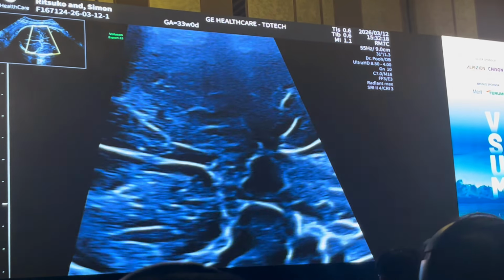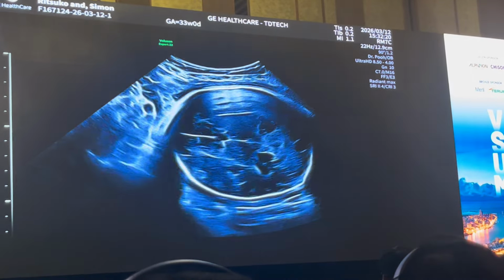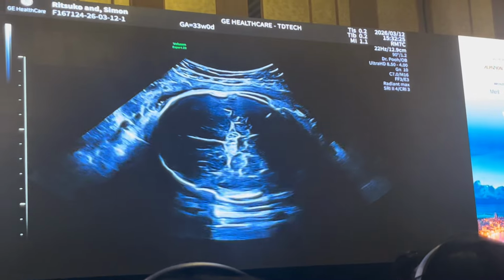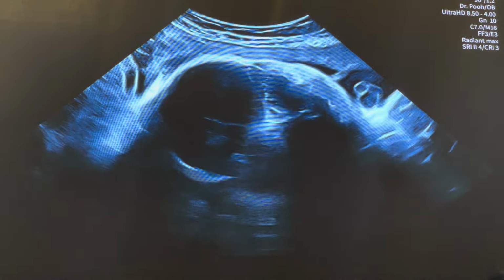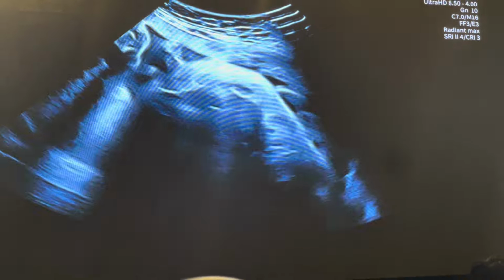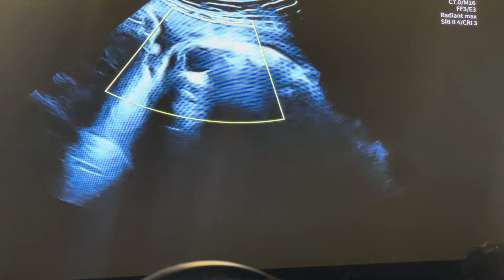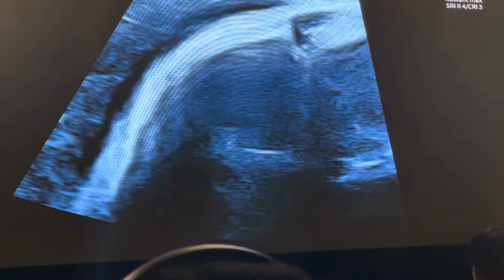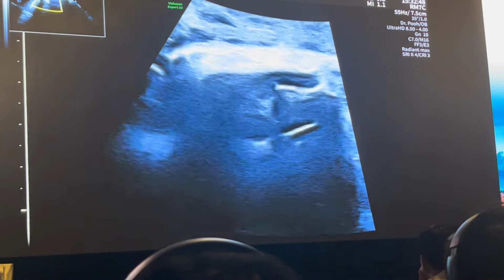And to bring that into view, you need to come down to bring the optic chiasma into view, and at the same time, try and catch the orbit of the baby's eye, because you want to see whether the optic nerve is present. This becomes important in septo-optic dysplasia, and as you come up to magnify the image of the baby's eye, you can then try and turn around and catch the point where the optic nerve leaves at the back of the baby's eyeball. And that can be challenging, but let me try.